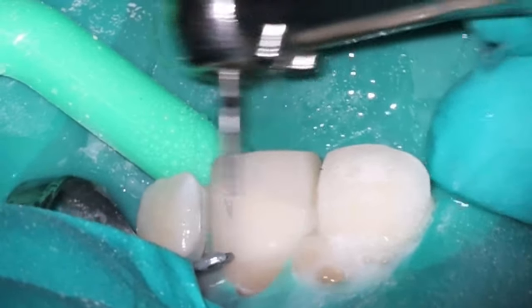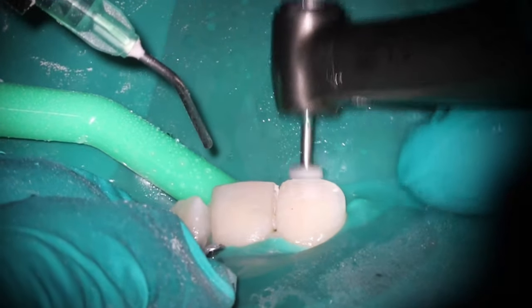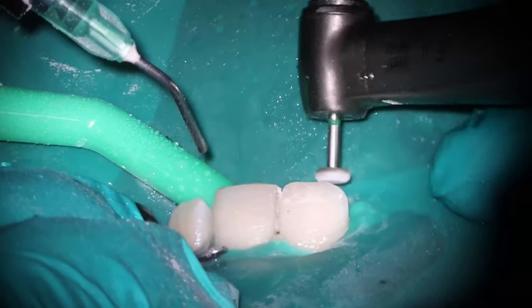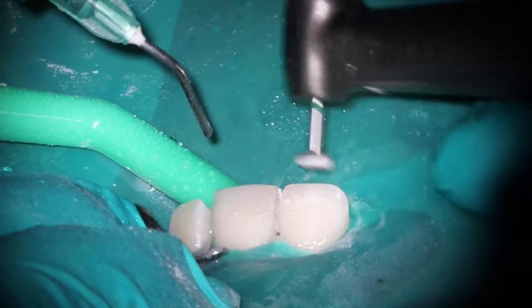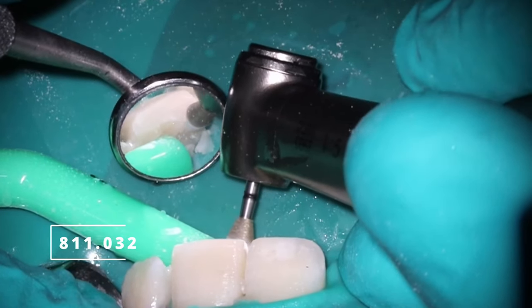B, I like having the little scratches on there for when I go into polish so I can see if the contours are off at all. This is what I was talking about, just a quick small little adjustment. You can already see how much better 8 looks by just adjusting that. I barely removed any composite there or any tooth structure, and it already looks much better.